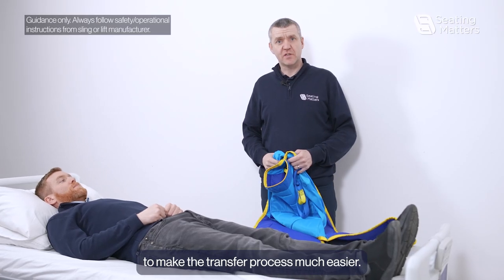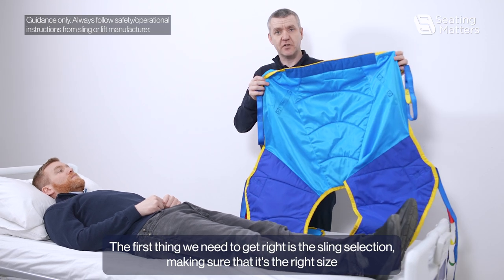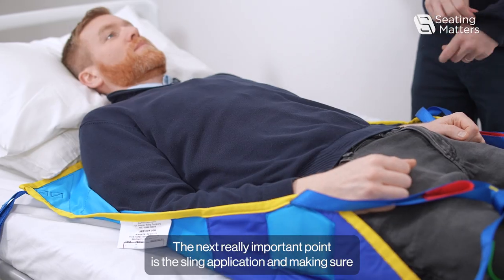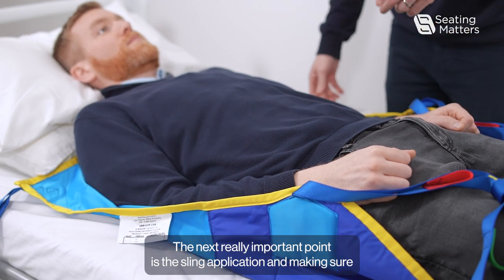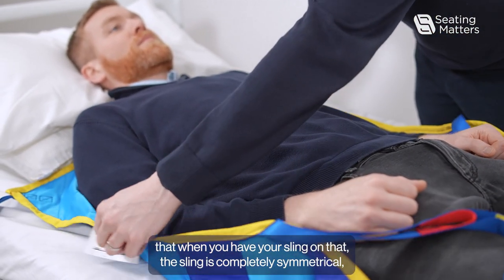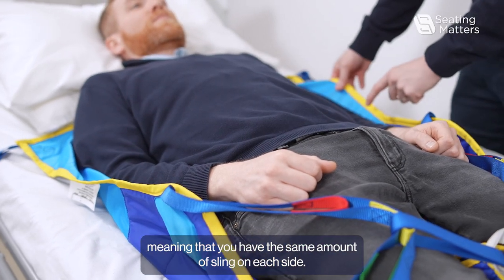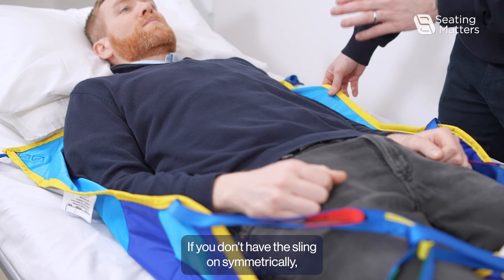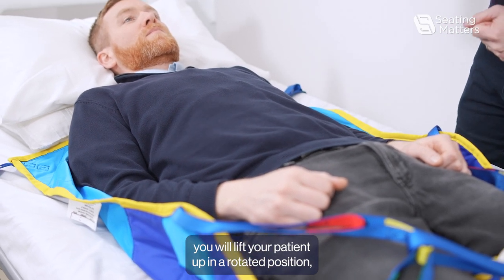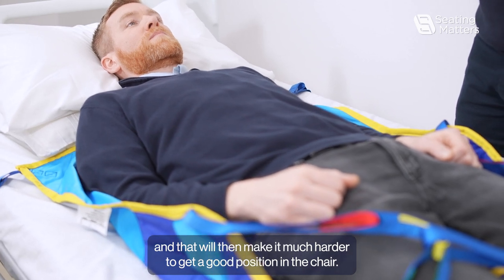To make the transfer process much easier, the first thing we need to get right is the sling selection, making sure that it's the right size and the right style for your particular patient. The next really important point is the sling application, and making sure that when you have your sling on, that the sling is completely symmetrical, meaning that you have the same amount of sling on each side. If you don't have the sling on symmetrically, you will lift your patient up in a rotated position, and that will then make it much harder to get a good position in the chair.